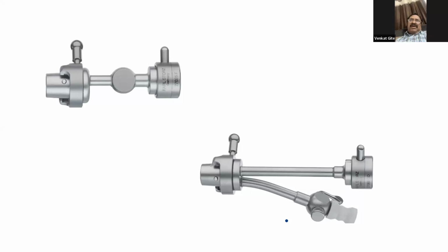So why is there a need for an integrated bridge? Integrated, I mean the bridge attached to the sheath and the telescope. You can remove a DJ without removing the sheath. If there are two DJs, you can remove one DJ and then remove the other one also, rather than doing two cystoscopies. Yes, sir. These are routinely done everywhere.